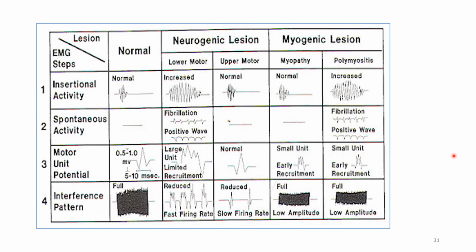So up to now, what we have discussed is electromyography, and how the pattern will be in a neurogenic lesion and a myogenic lesion. We have seen the definition, the principle and the recording technique. The recording technique includes surface electrodes and needle electrodes, also recording electrodes and ground electrodes, an amplifier, and one more thing, a transducer.